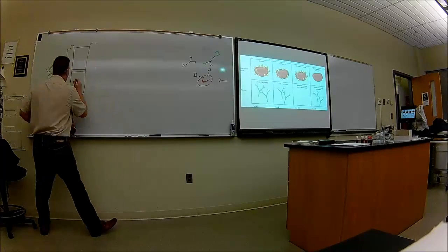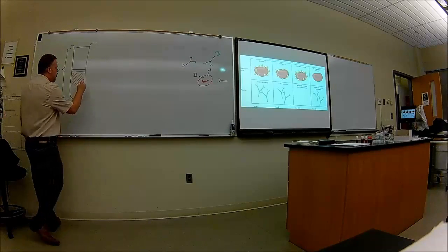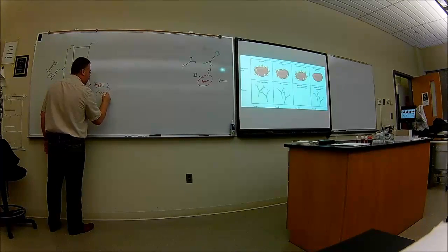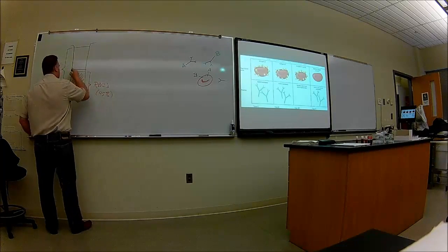All the heavy stuff is gonna be down here, which is the majority of the stuff. What is this? These are the red blood cells. And this makes up about 45% in a healthy person. 45% of the whole blood. Then you're gonna have this area here, very thin area.